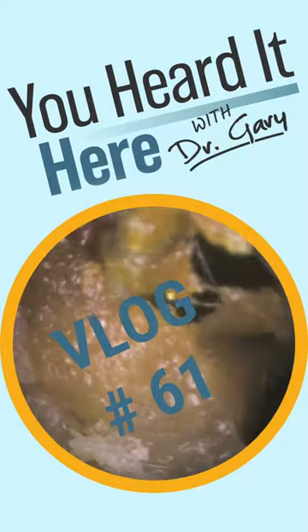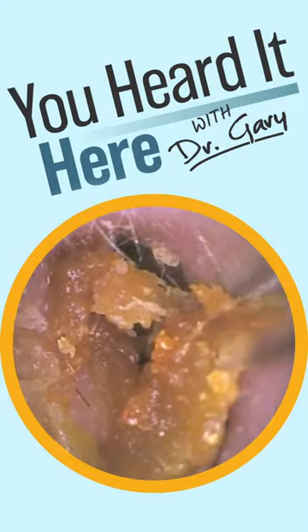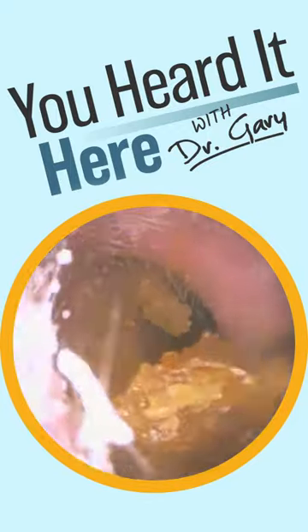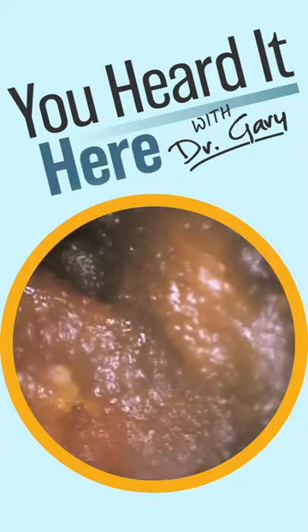In this case we're going to take a look at a patient that has dry wax at the outside and soft gooey wax on the inside. It sounds like one of those old candy commercials, and I bet this doesn't taste nearly as good.